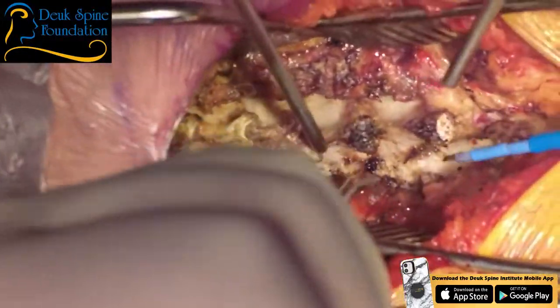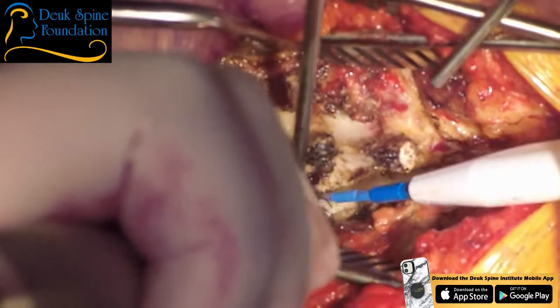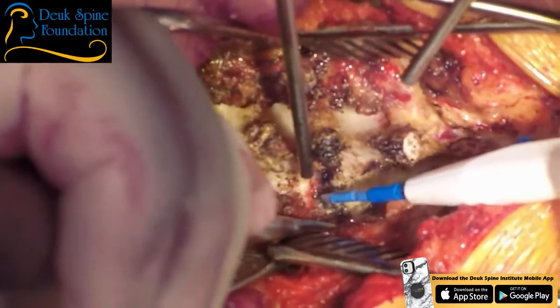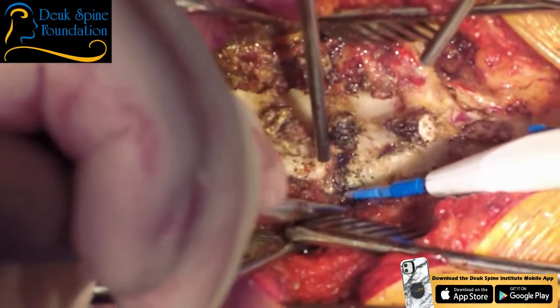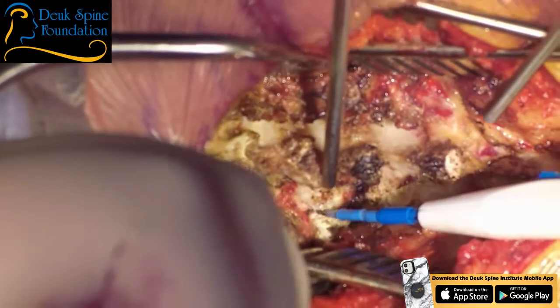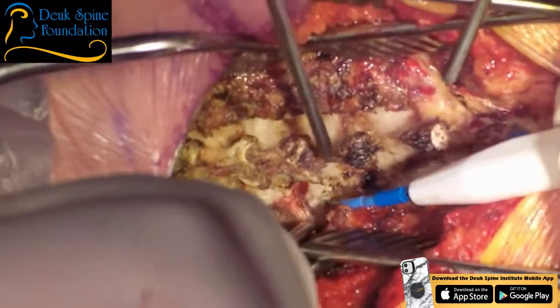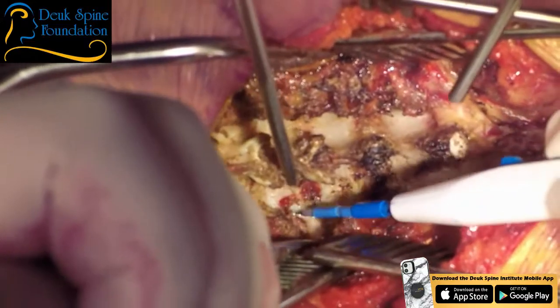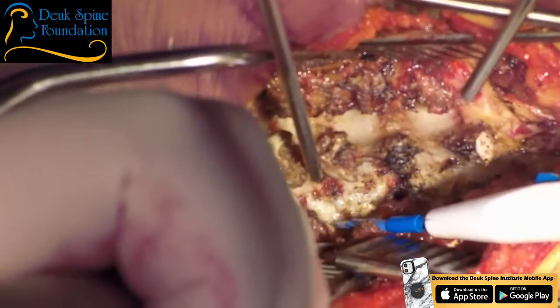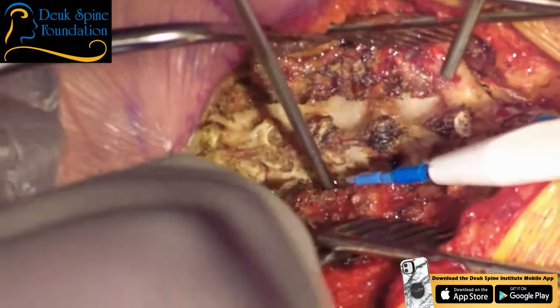I'm just gently retracting the soft tissues off the spine, and I'm releasing them with the Bovie as I slide along the bone. And we're going to go lateral enough on every one of these cervical vertebrae. We're going to go lateral to where we just get to the lateral margin of the lateral mass, and it starts to dive anteriorly.